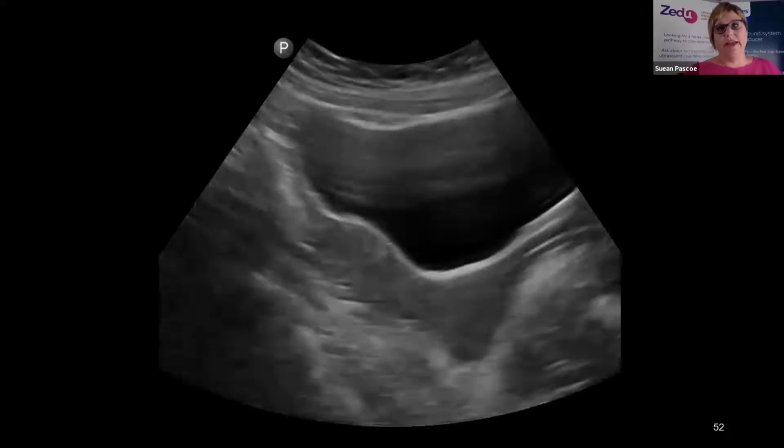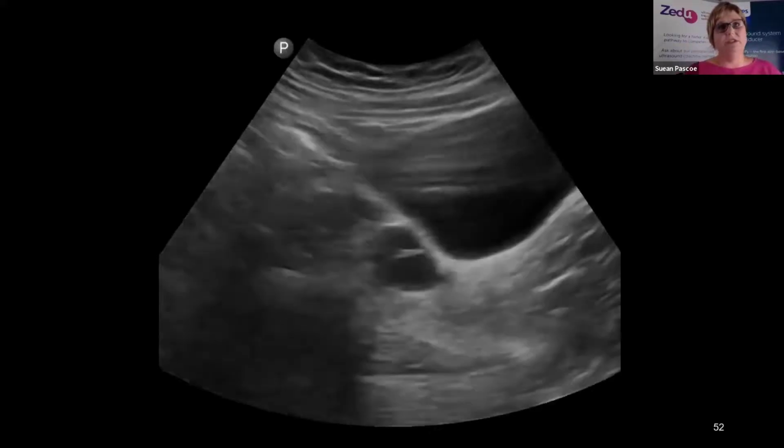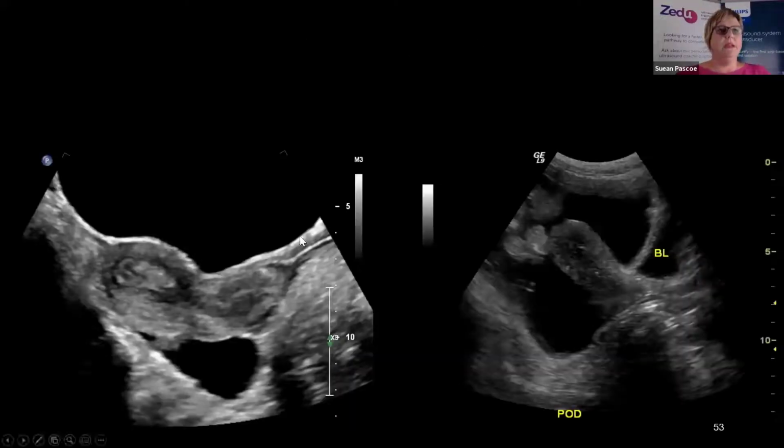If you have a patient that has pelvic scarring or adhesions, they might have endometriosis, fluid might not collect in all the typical spots. So you need to assess the pelvis for fluid. So go from the right iliac vessels and sweep over to the left iliac vessels. When there's free fluid, as you can see, bladder up here, this is an enormous bladder, someone's very full. And then we've got the uterus, vagina stripe just here. And then deep to that is the pouch of Douglas. And this is an extreme case.